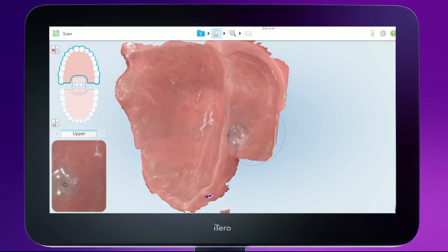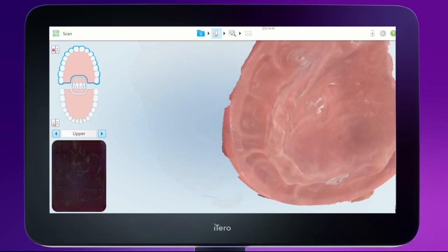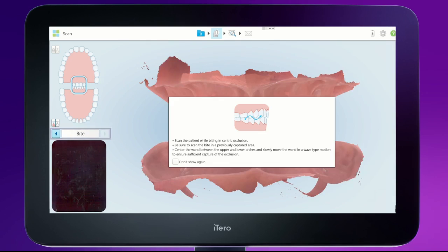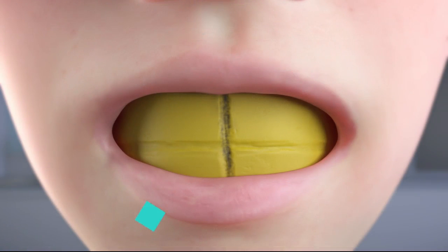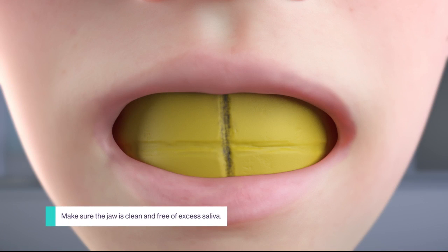Evaluate the scan and capture any missing anatomy. Tap the arrow segment to switch to the jaw relationship. Use a putty matrix to create vertical dimension and place the putty in the mouth.